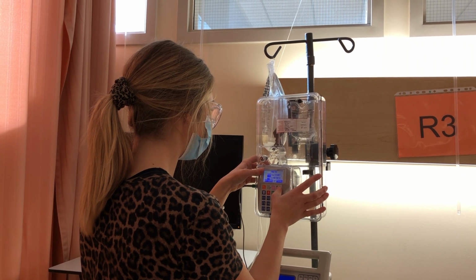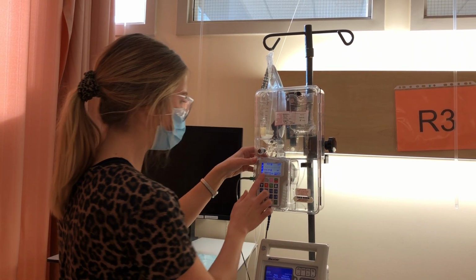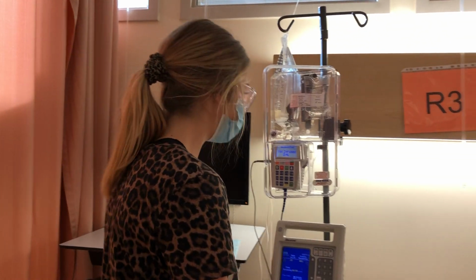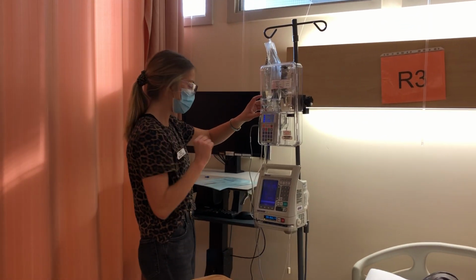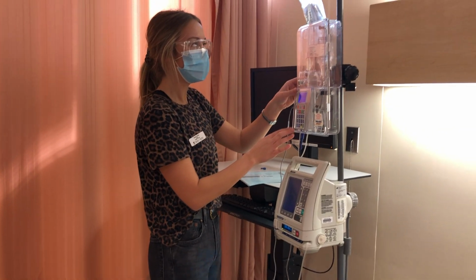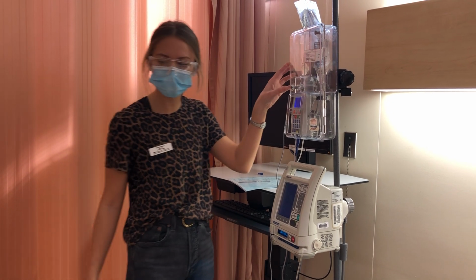And then I would press run to start. So again, clean for 3, let it dry. Making sure that the green light is going. I'm making sure that everything is unclamped, so it'll all be closed up. And then I would be documenting on my MAR with my other nurse that checked it off, that I changed the bag and the date as well as the time that it was changed. And then I'd be continuing to monitor my patient for any signs of distress.